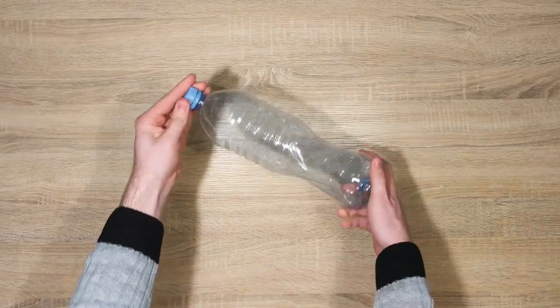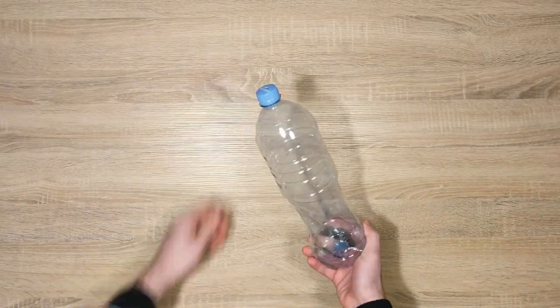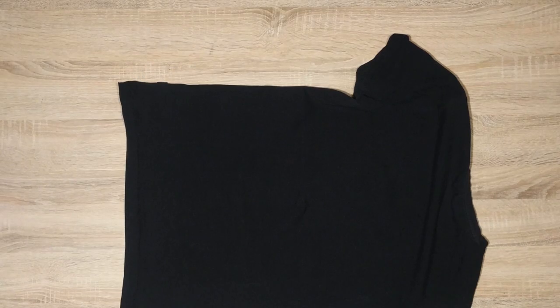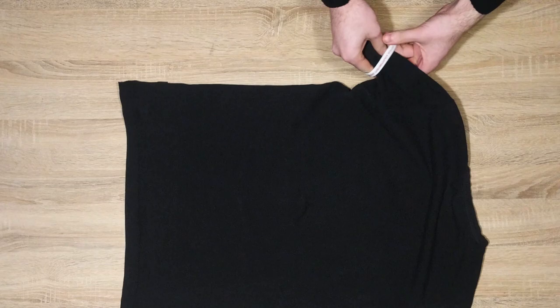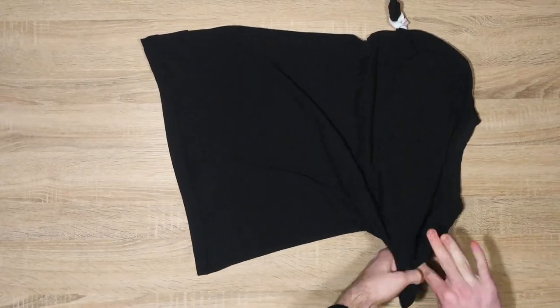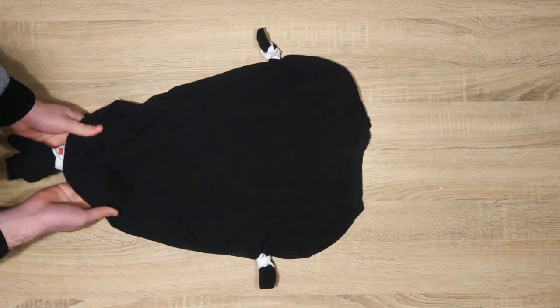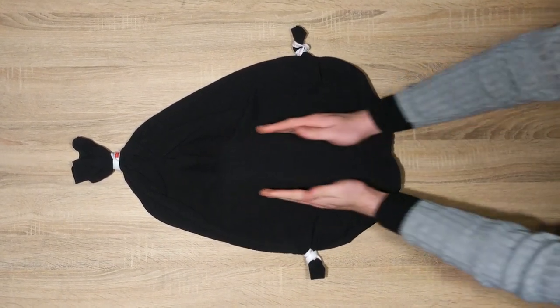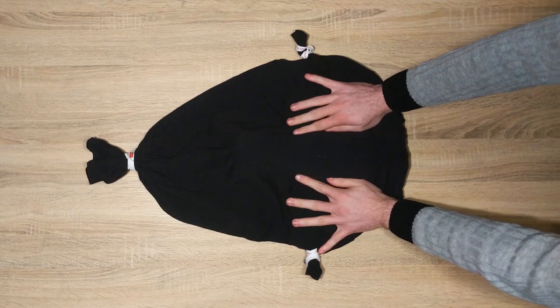To make the dummy, first ensure that the two-liter plastic bottle is completely empty and that the cap is on tight. Take the t-shirt and tie a rubber band around each of the armholes and the bottom of the shirt. Then insert the two-liter bottle into the shirt and place it where a person's breastbone would be, in the center of the person's chest.